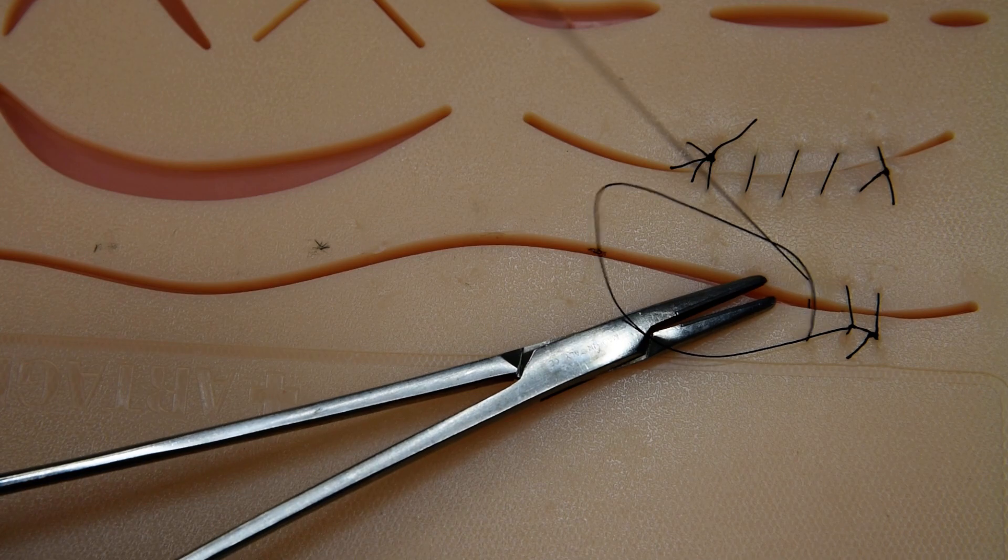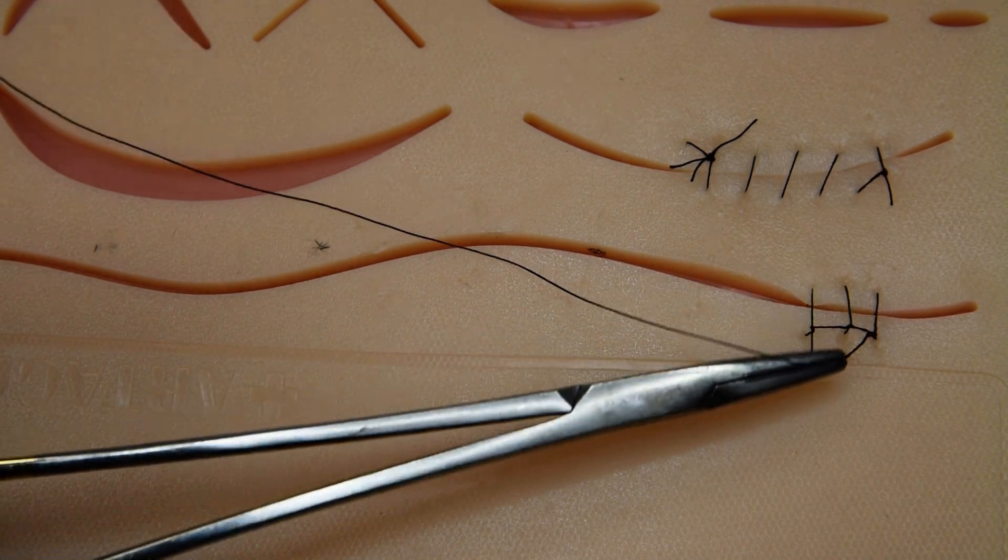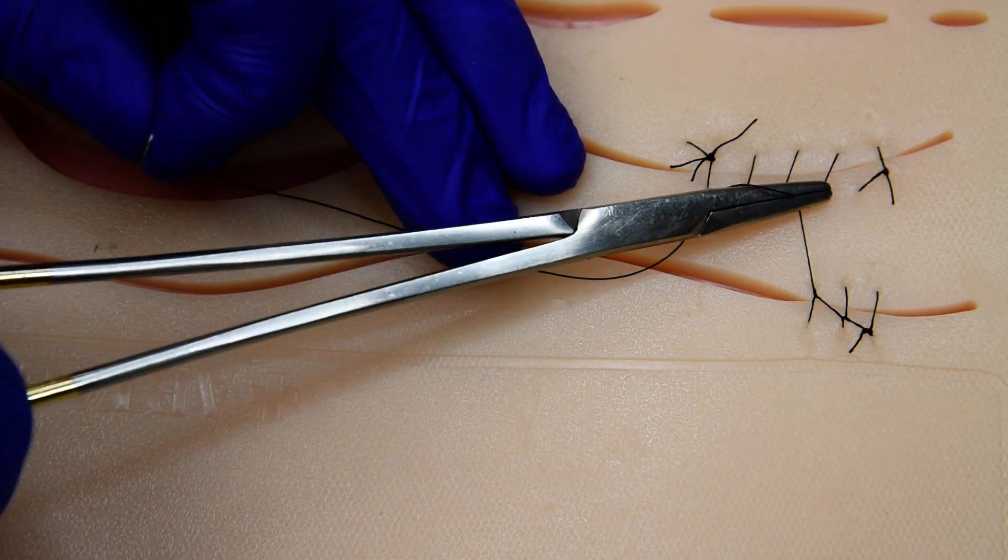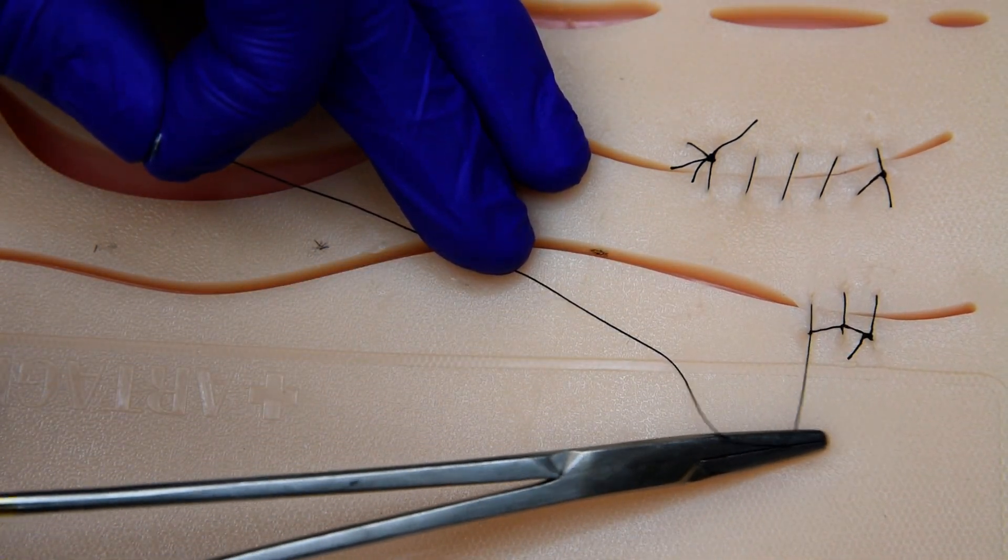and as the loop gets close, we tighten it, rock it across the incision, and lock it to the buccal side.